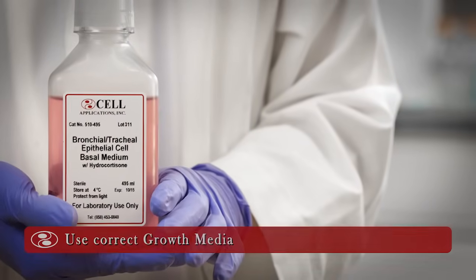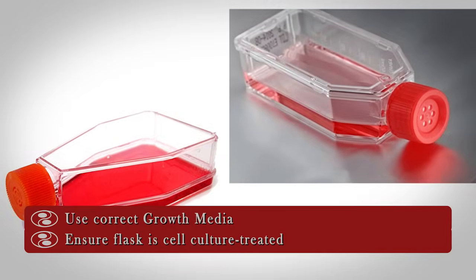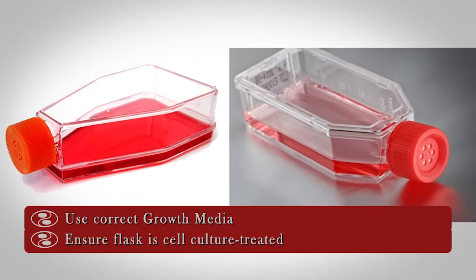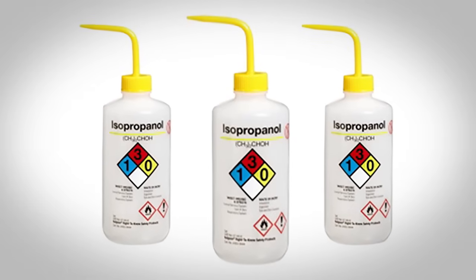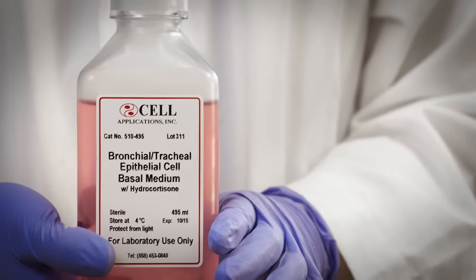Ensure that you have the optimized cell-specific growth media. Also, confirm that your cell culture flasks are suitable for primary cell culture. We recommend using Corning, Greiner, and other appropriately treated flasks. To reduce the chances for contamination, use 70% isopropyl alcohol to wipe down working surfaces, media bottles, and thawed cryovials.